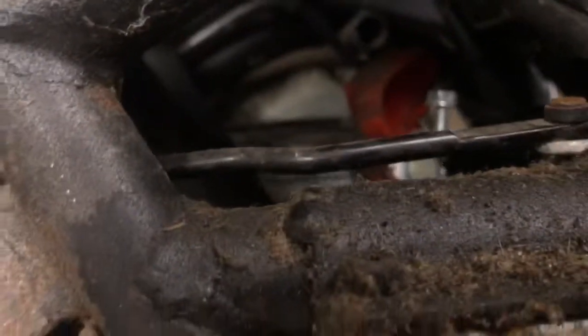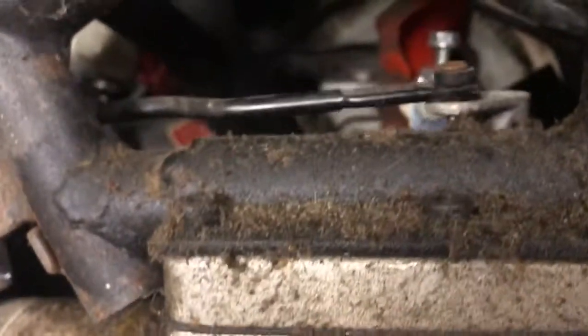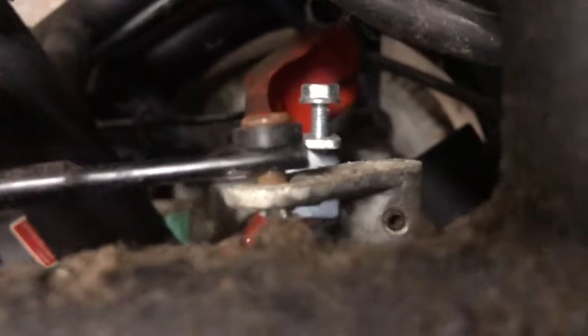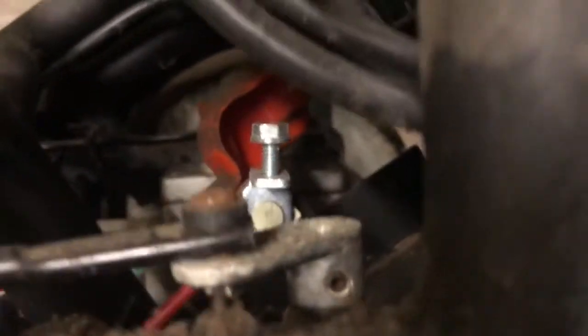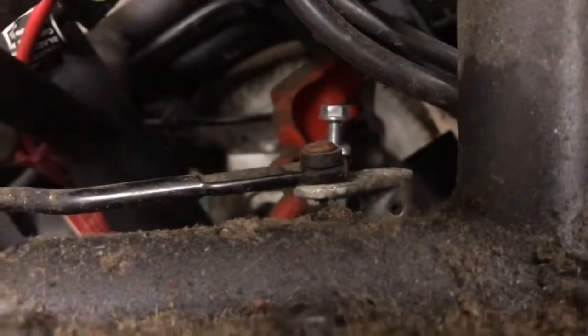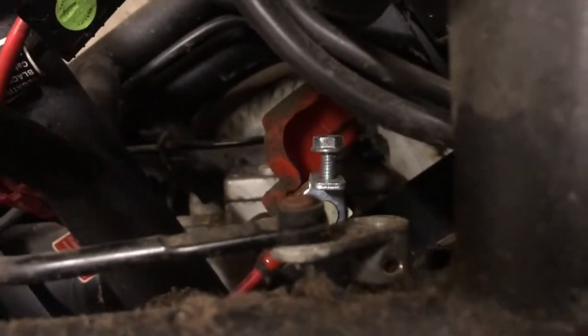Okay. There we go. Another option is they usually put either Allens, you can see it right there. Sometimes it's a punch. It's either one or the other. It's either an Allen, or you'd have to get a punch and punch it out. That is another option. If you don't want to mess with this like what I'm doing, you could take this lever off, and do it that way. Some people do this differently. This is all up to you.